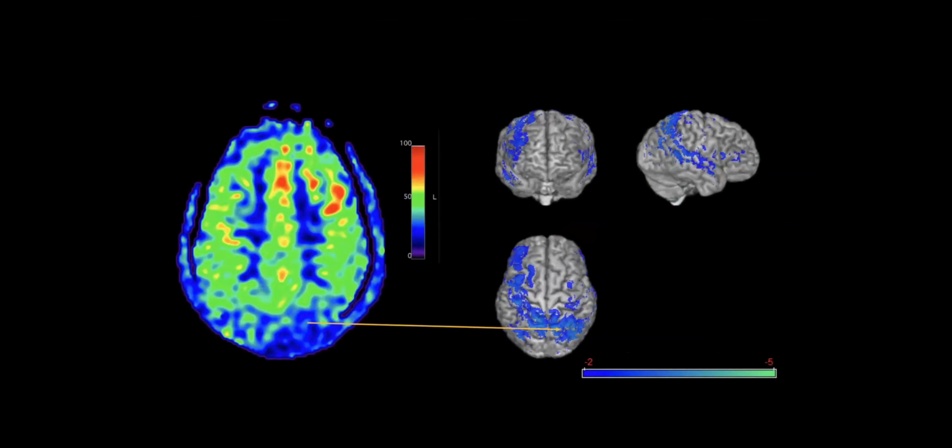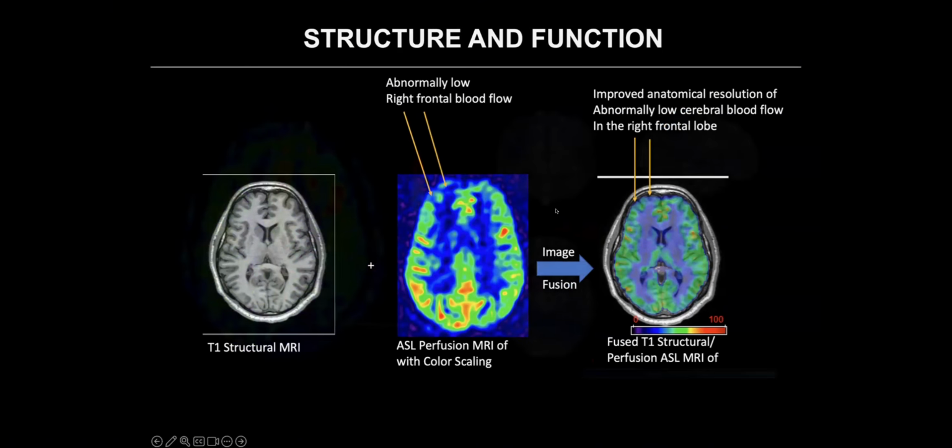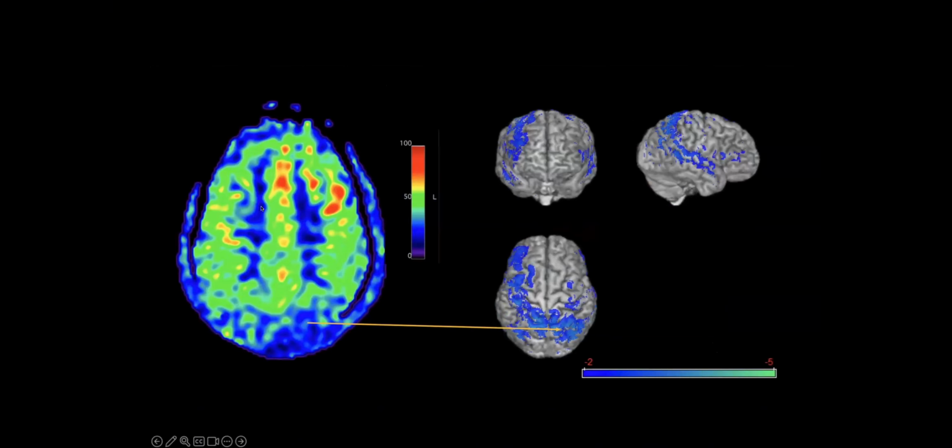And of course, we can see another individual who had a traumatic brain injury, a motor vehicle collision, as I can recall. This individual also had, I believe, a rear-end collision. So they hit the back part of their head, and you can see low blood flow there. But you can also appreciate on the statistical map additional areas of low blood flow that wouldn't otherwise be appreciated. You see this classic coup-contrecoup injury where, in neurological convention, the left frontal lobe is worse than the right frontal lobe, but there's a really asymmetrically worse area in the right parietal lobe.